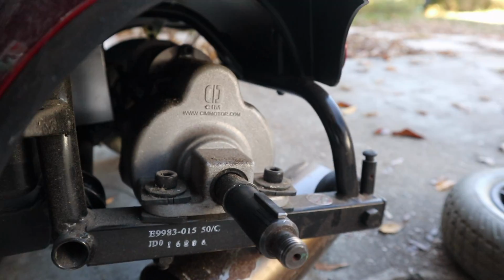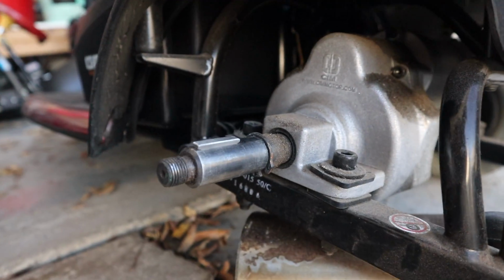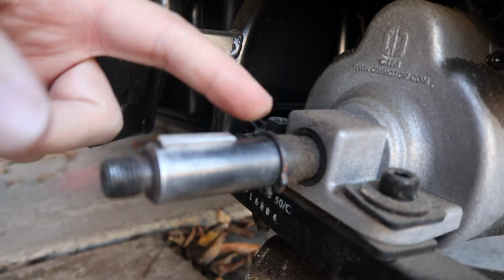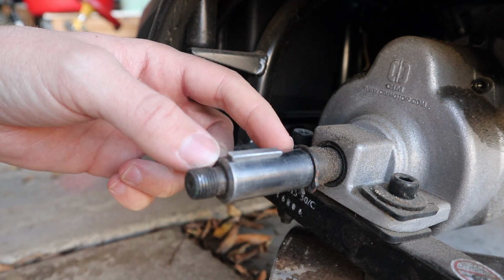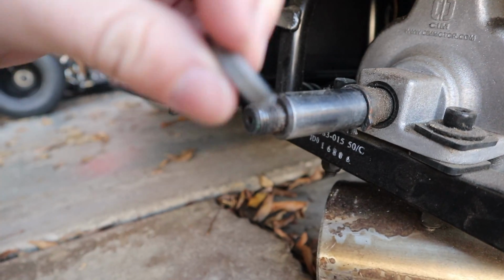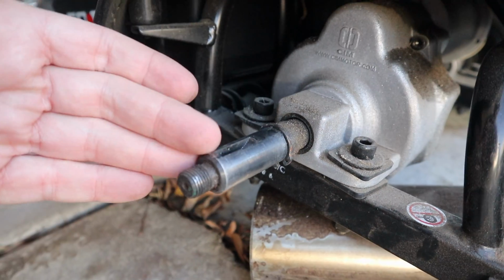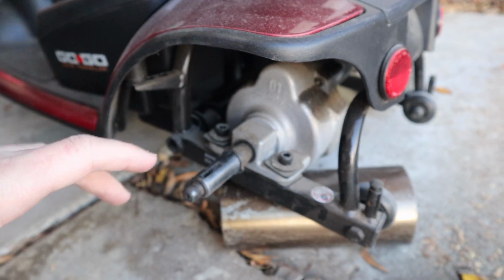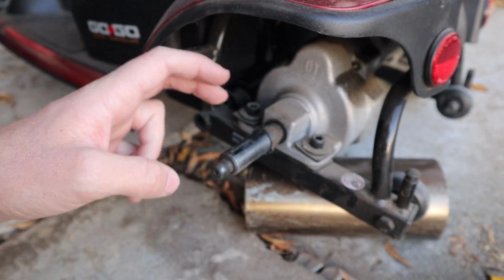Now from here, you're gonna want to take a look at your shaft size. With my shaft, measuring from the end point, which has this little lock collar, it's about 2 inches. Then I'm gonna remove this key and measure what diameter it is. I already did it, and it's a 3/4 inch shaft. Then I ended up picking up hubs and other extensions that are 3/4 inch.